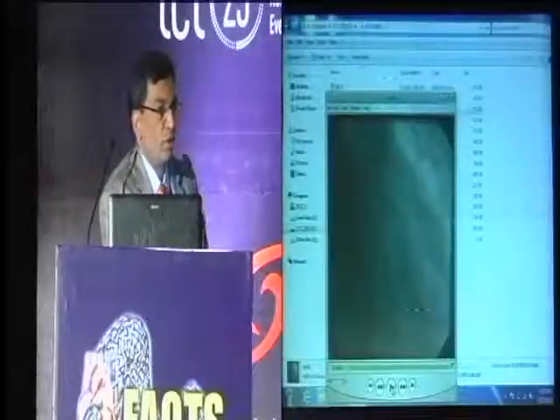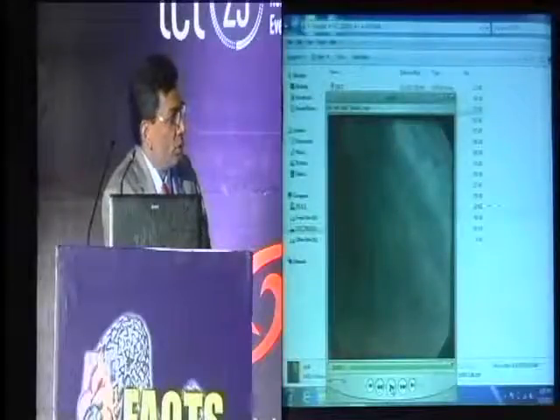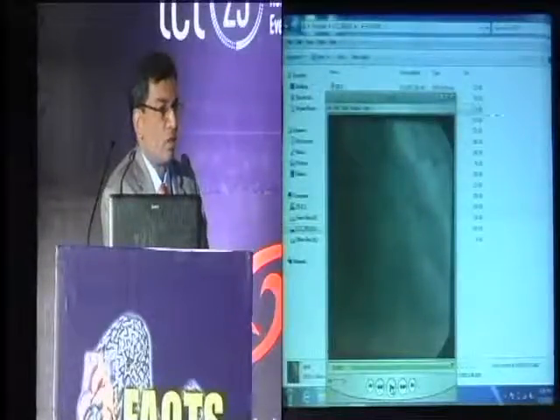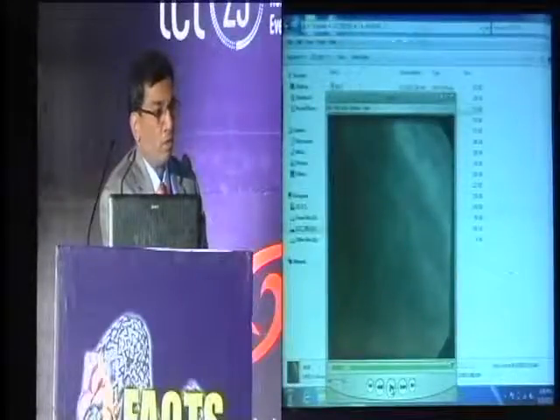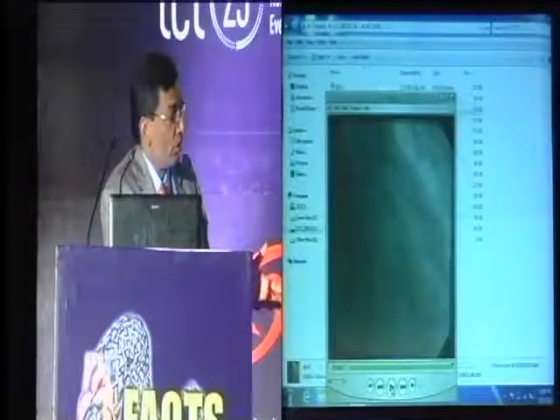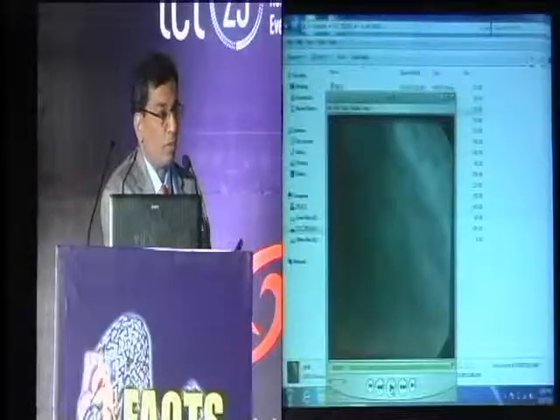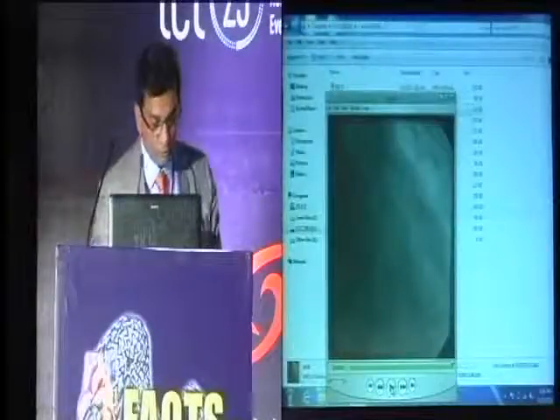The key of bifurcation disease management, particularly in an acute situation with significant thrombus burden, is the importance I want to show with this case. She was somewhat hemodynamically unstable and a morbidly obese patient, so hemodynamic support device placement was not without complications. Thrombus aspiration is one way to try and hemodynamically stabilize the patient quickly. So we wired the LAD first and did thrombus aspiration.